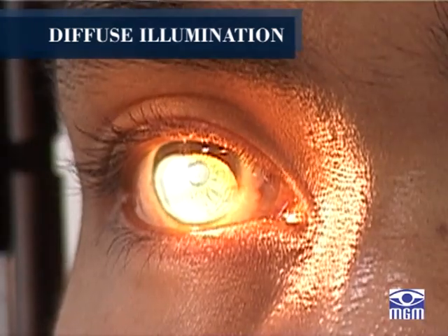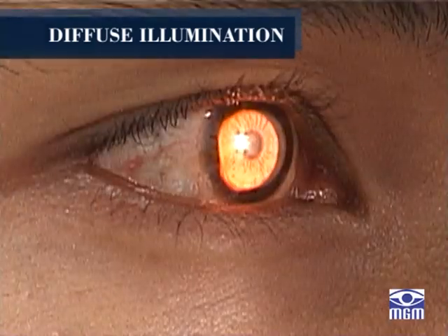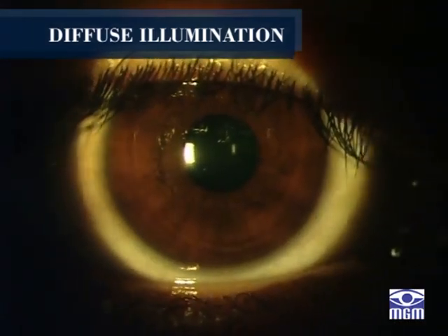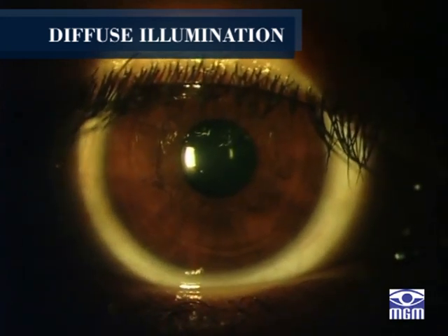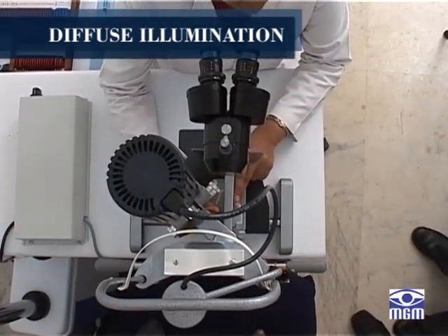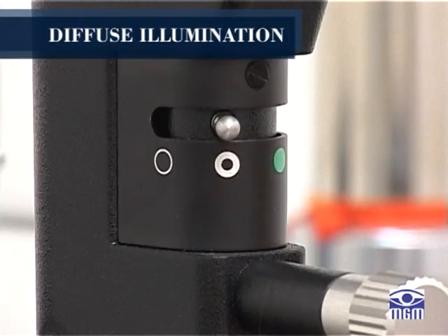Here, the slit illuminator is set at its largest aperture and the diffuser is put in place. The inspection in diffuse light often provides the first indication of abnormalities present in the cornea. Here, the angle between the slit lamp and the biomicroscope is 30 to 40 degrees. The slit width is wide open and the neutral density filter is used.